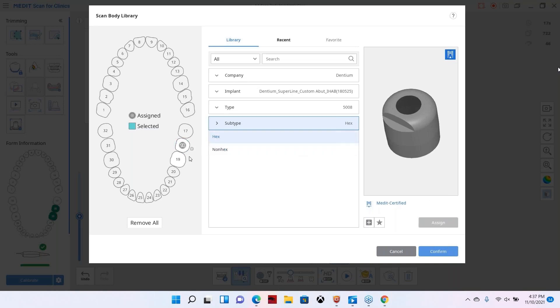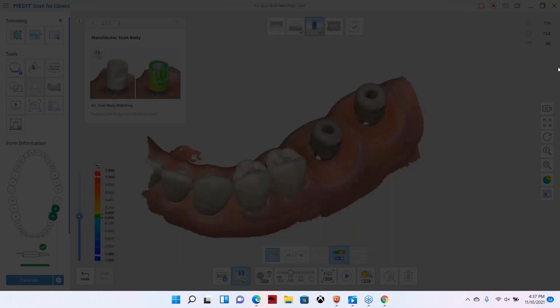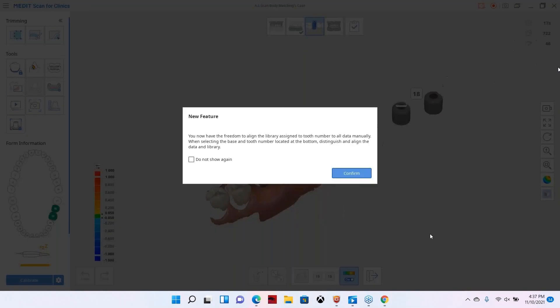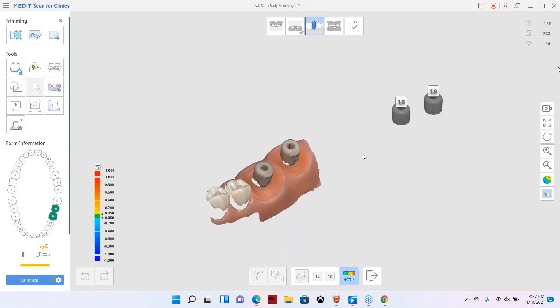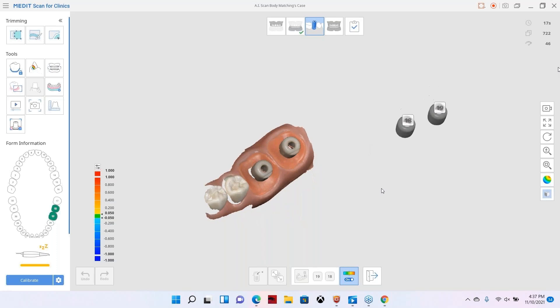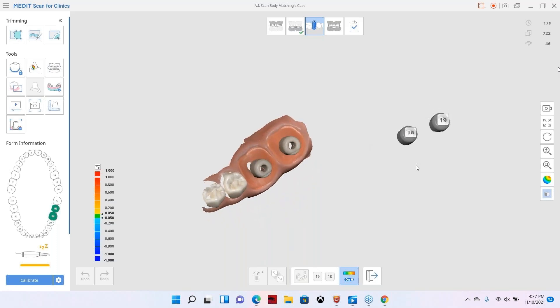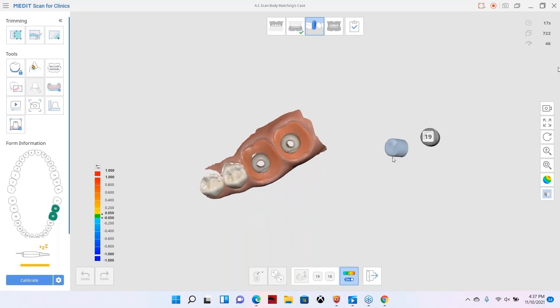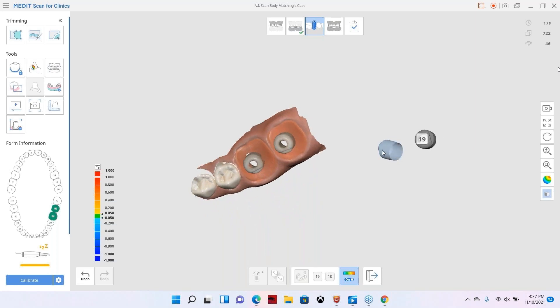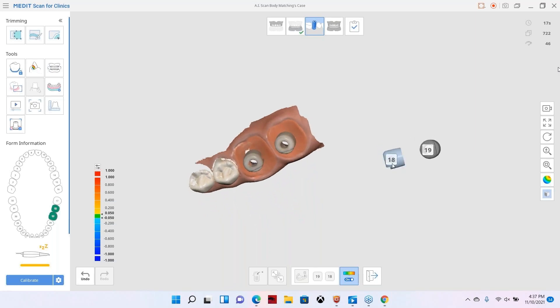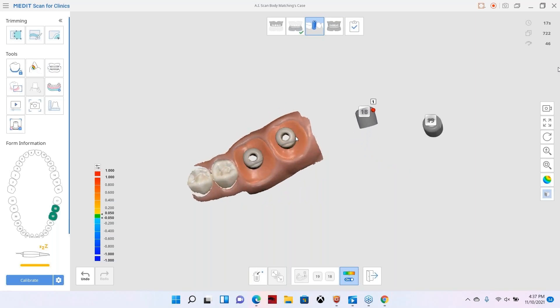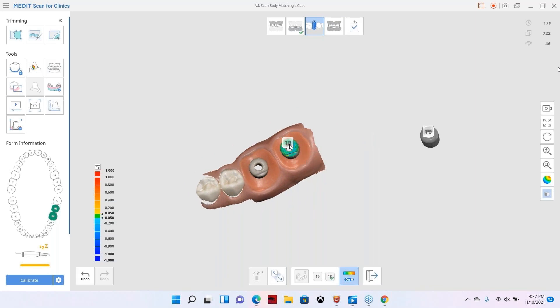We're going to go down here and select the scan body library that I will be using. Click here and then I'm going to go down to 5800008 and we're going to select hex. If you look to the right, there's the scan body that popped up there. So we're using the same scan body for each tooth so I can assign it. I'm going to assign it to number 18 and then I'm going to assign it as well to number 19. Now if you had different scan bodies for different tooth, you would select the different libraries and assign them. And then from there you would confirm. Because this is a new update, it just tells you about the new feature and you can click don't show again or just confirm.